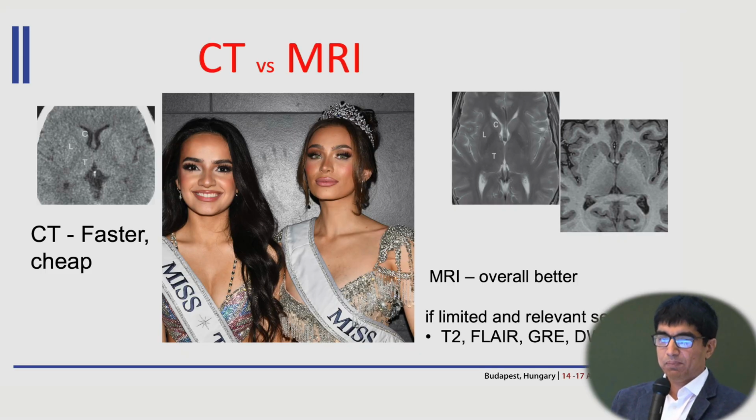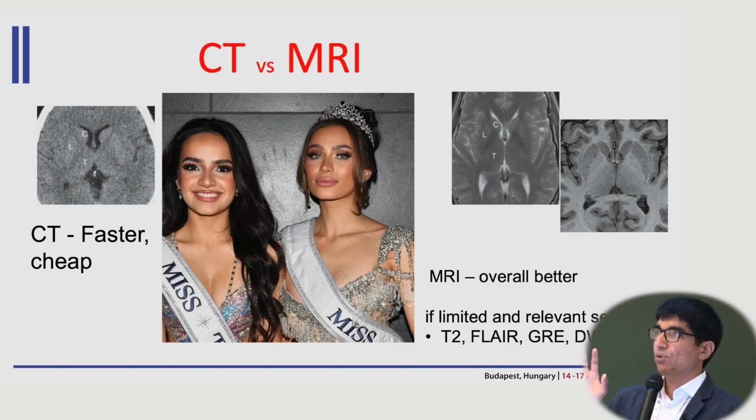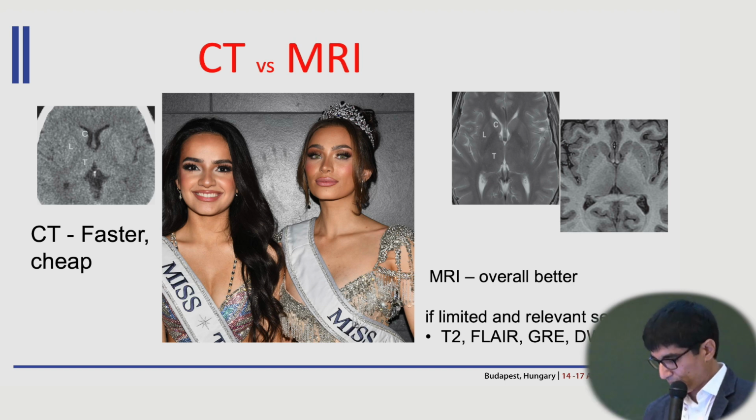So which one to pick, CT or MRI? There are many centers in the world which work only on the basis of CT. Some work on MRI, and some have a combination of both. But CT overall is a faster and cheaper investigation. MRI is overall better if you focus on limited investigations, limited sequences which can be done in a few minutes, and you do not compromise on the door to needle time.